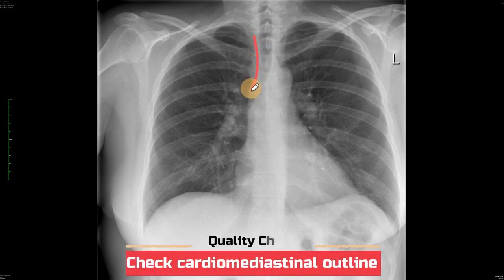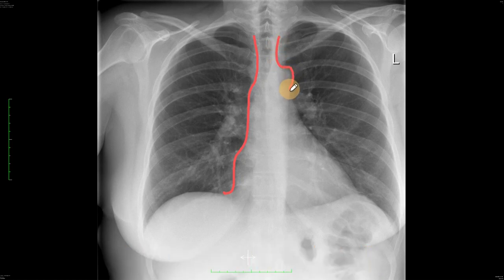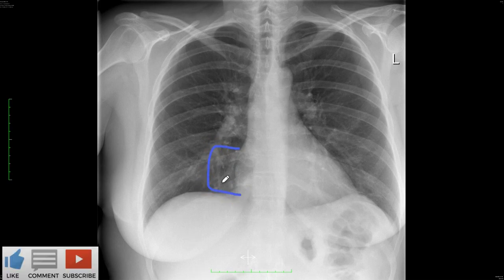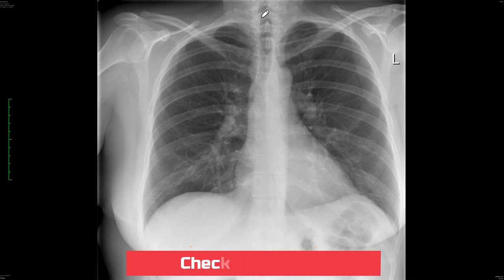The second thing you need to check is the cardiomediastinal contour. Follow the cardiac contour - it should be nice, clear, and sharp with no fuzziness. As you come down you see the aortic knuckle, which should be crisp and clear, and the left cardiac border should also be nice and clear. Any fuzziness along this line should make you think there may be something wrong with the adjacent lung. The most important part to check so you don't miss any significant consolidation is the right and lower cardiac border - if this is fuzzy it can mean right middle lobe lung pathology.